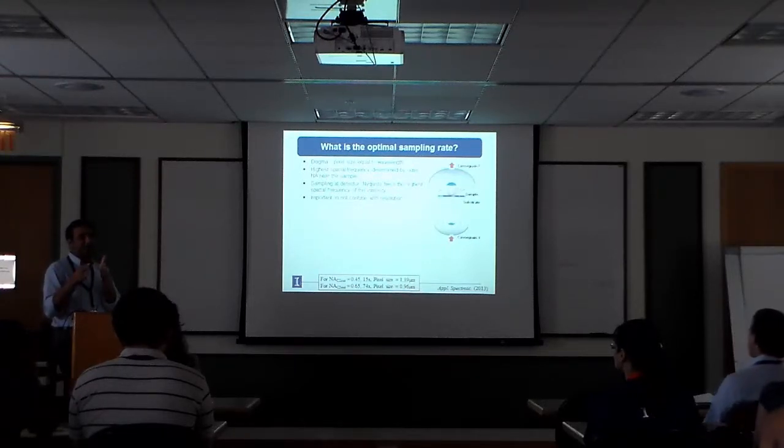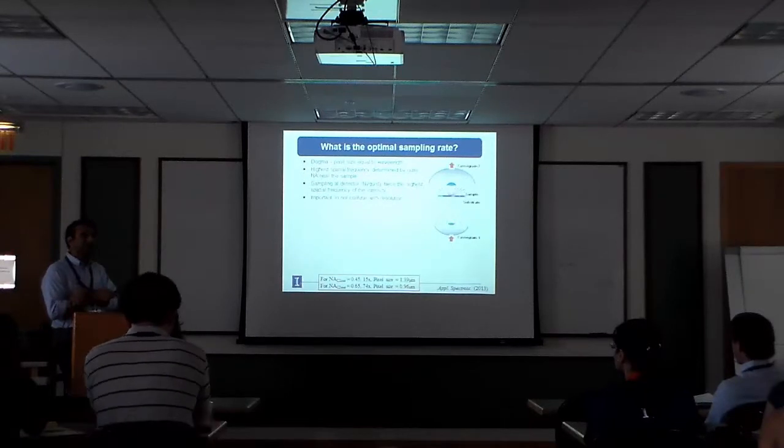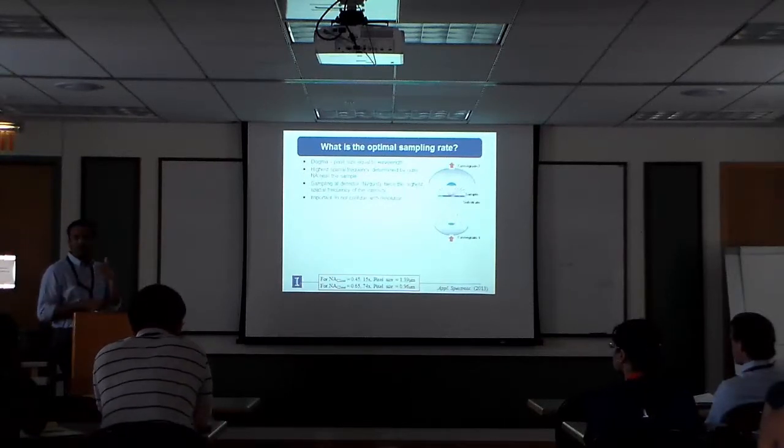So this is a very trivial question. What should be the spacing of the detectors, the center-to-center spacing of the detector? It should be twice the highest spatial frequency you get, right? This is absolutely trivial, first principles knowledge. It turns out that in the infrared domain, that frequency turns out to be 1 micron. Okay? If you think about it, the central wavelength in the bandwidth of our measurement is about 5 microns, right?